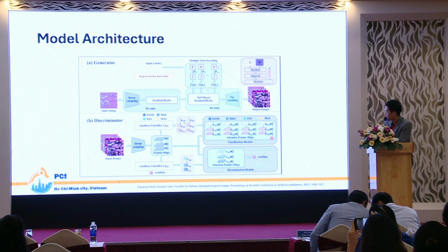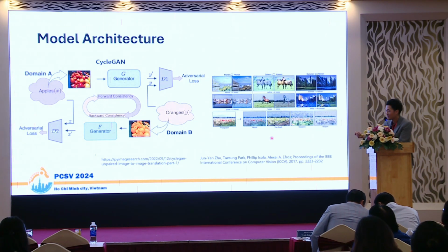My team used, simply put, a CycleGAN model to solve this problem. CycleGAN is one of the common models used for style transferring.